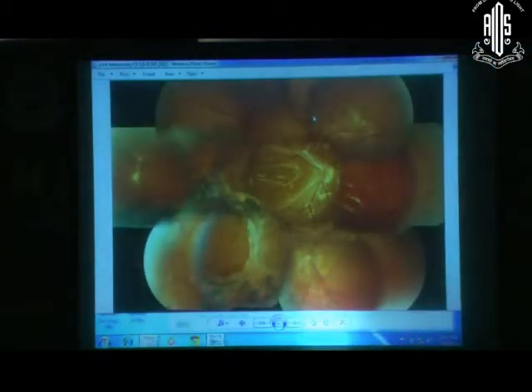Although the aim of the surgery is not to have anything spill over to the macular area, whether your bleeding is there or make sure that the retina goes flat at the end. And this is the final post-op picture. So you can see that the macula finally got well settled in the central area with a reasonably good visual improvement to some extent. But you see the extent of posterior retinectomy which it went up to, all the scarring. But end of the day, the central area is well preserved, although the retinectomy went much more than what I had planned to begin with during the surgery at that stage.